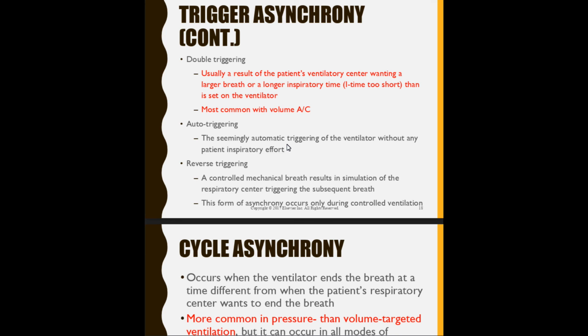All right, so what's happening here is the patient is getting a breath from the ventilator, and for some reason, the patient breathes. That breath triggers the brain to send a signal to breathe again.